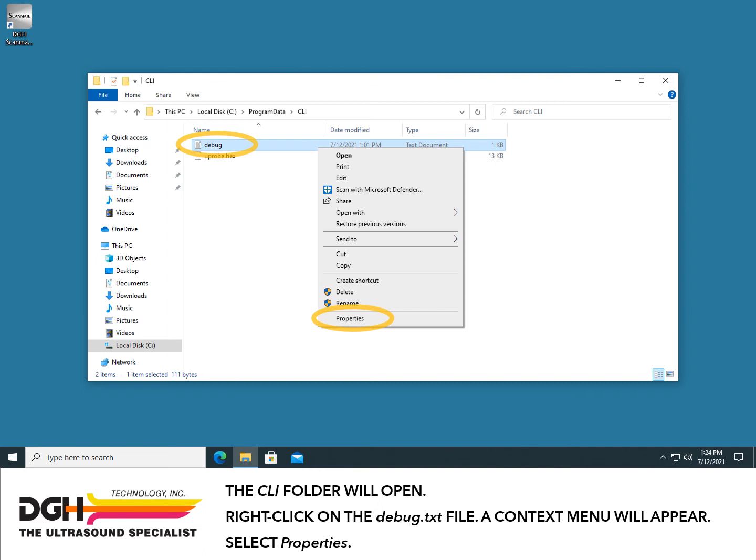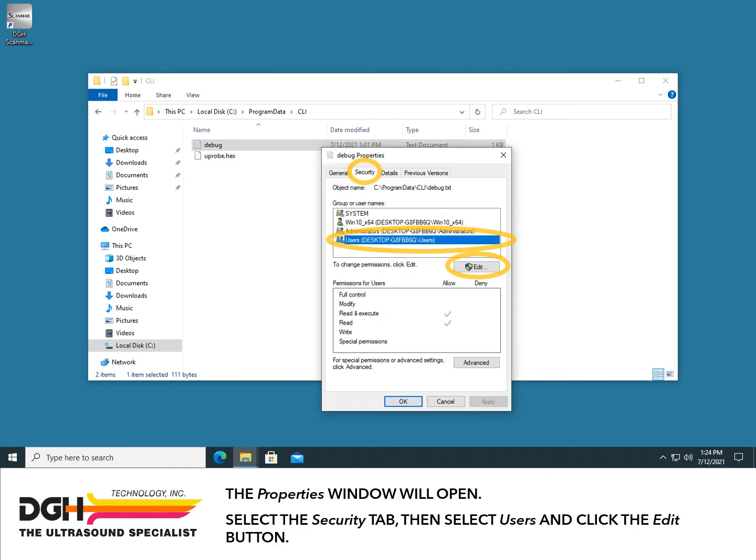A context menu will appear. Select Properties. The Properties window will open. Select the Security tab, then select Users and click the Edit button.